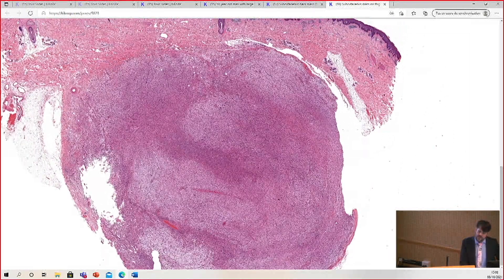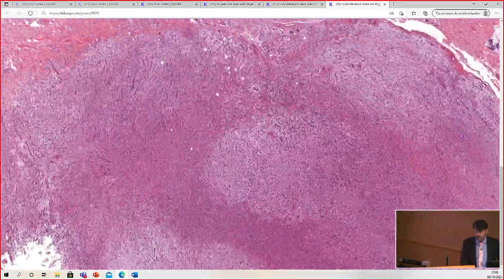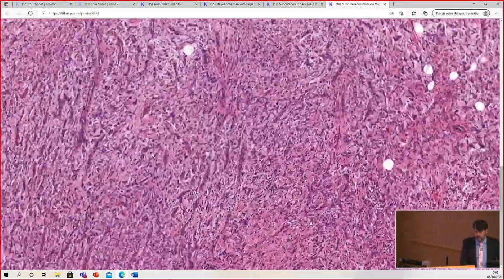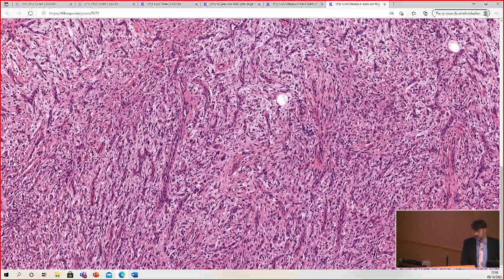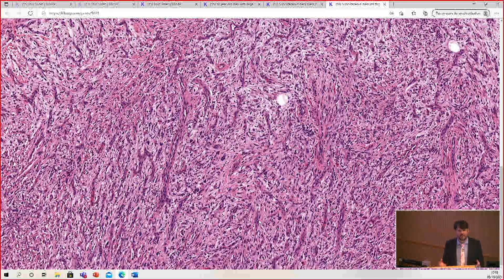From low power, you can see there are some cellular zones and some less cellular, maybe pale myxoid areas. As we go to higher power, the most striking thing about this tumor is the blood vessels — a crazy amount of blood vessels, so many packed in one place.